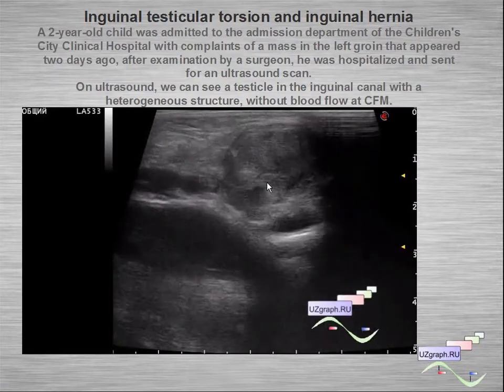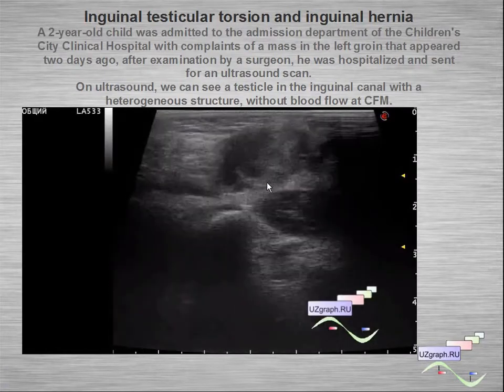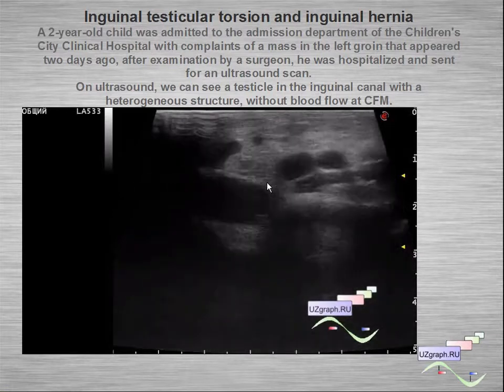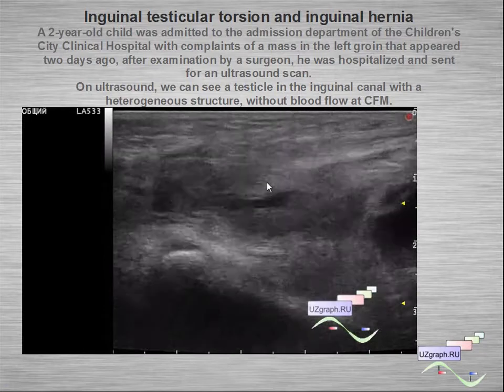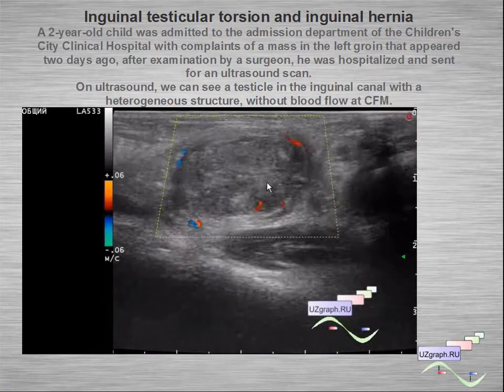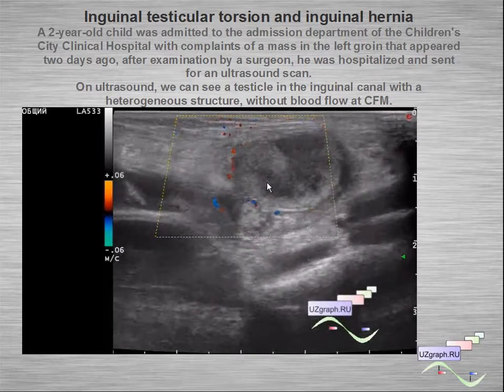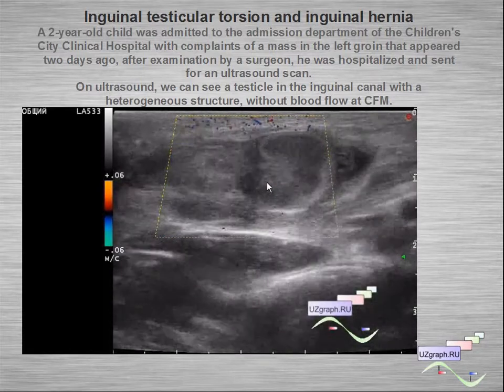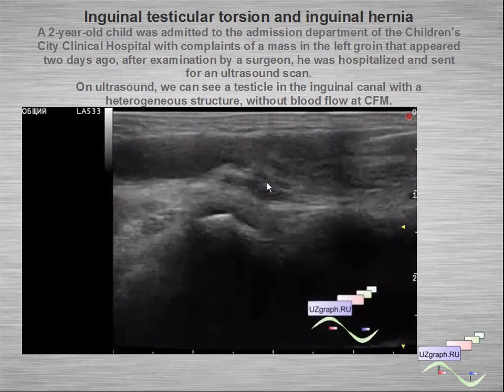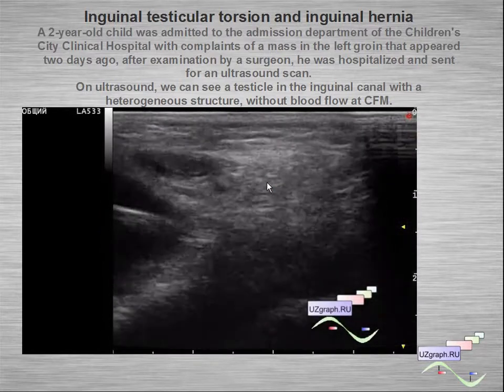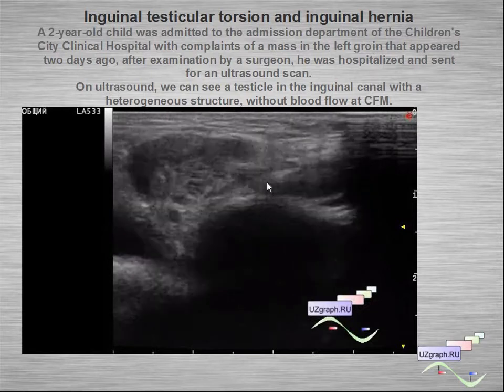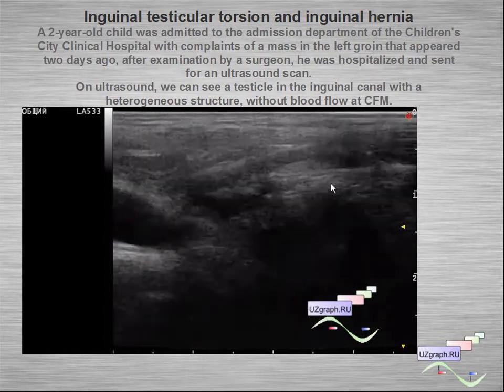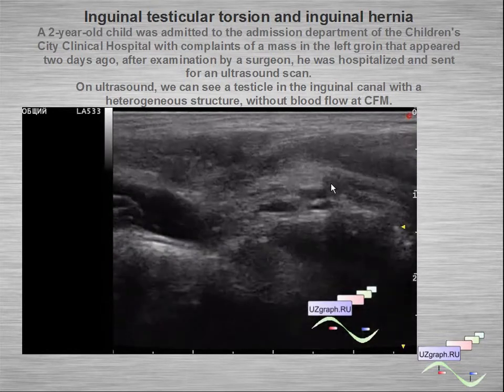Next case: inguinal testicular torsion and inguinal hernia. A young child in the children's city hospital presented with complaints of a mass in the left groin that appeared two days prior; after examination by a surgeon he was hospitalized and sent for ultrasound. On ultrasound we can see a testicle in the inguinal canal with a heterogeneous structure and without blood flow on color flow mode.